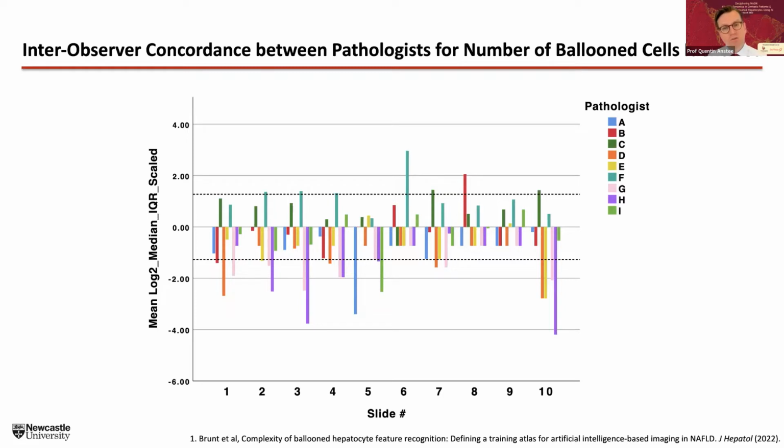And the first thing we looked for was, were there trends? And as you can see here, there clearly were. So each colour is a different pathologist looking at a different slide. And when the bar is going up from the x-axis, that indicates a pathologist who tends to see more balloon cells than the rest of their colleagues. And similarly, if it goes down from the x-axis, that implies pathologists who tended to see fewer balloon cells than their colleagues. And when they cross the dotted lines, that would be at least 1.5 standard deviations from the mean in terms of propensity to identify balloon cells.